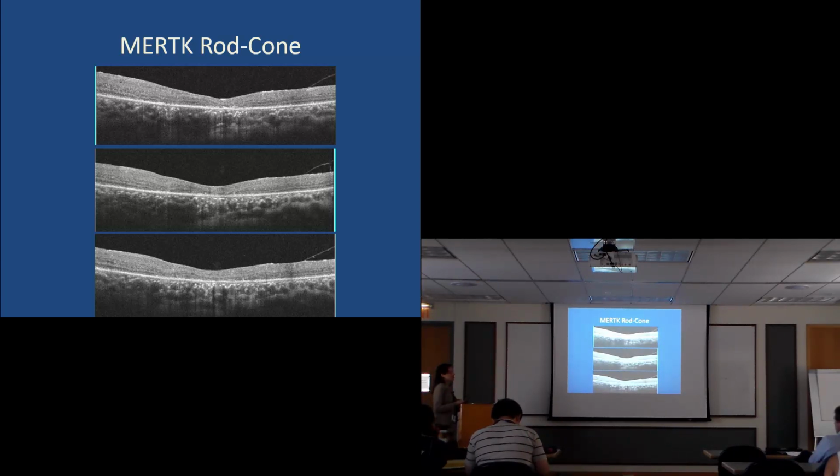And now these other subgroups, what they've done is with Leber's, they found the gene, they found it in a population of dogs. They were able to use a viral vector, an adenovirus, to put in the gene that was missing. They're subretinally injecting it into the eye, and now they have 5-year data on about 7 patients who are getting that in the United States, and they're having success with improvement in reading. So now we take OCT to find out what type of gene we are looking for. Is the genotype related to the phenotype on the OCT? And we're finding it is.